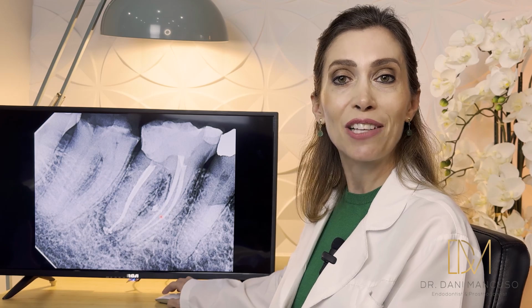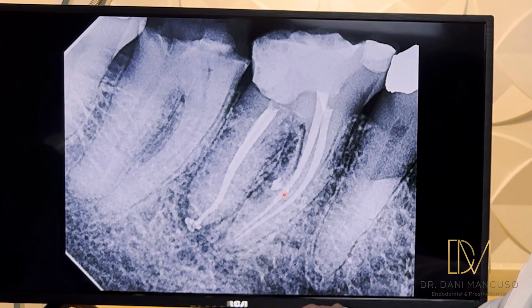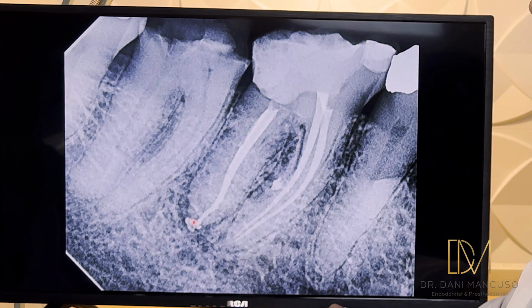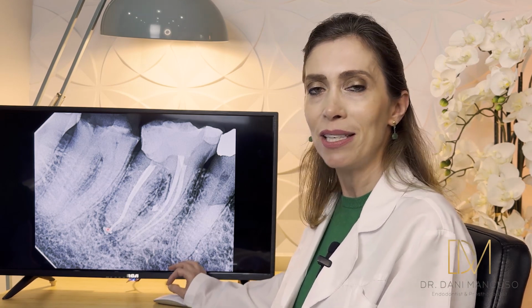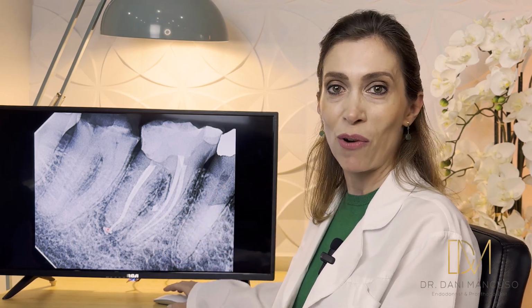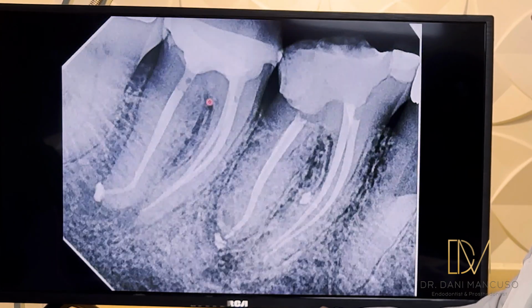so you can start seeing your lateral canals and the sealer puffs. When you see that, you are always happy, saying, oh, I've got it, I've disinfected enough. And pay attention to the apical portion as well, because you want the sealer to go over there. If it's a bioceramic sealer, there is no problem, and it's advised to have a tiny bit of that extrusion. It means that you've done enough patency when you were cleaning your teeth. The filling was a semi-permanent filling, and that gave us time to do the root canal treatment on the other tooth. And that is the completed root canal.